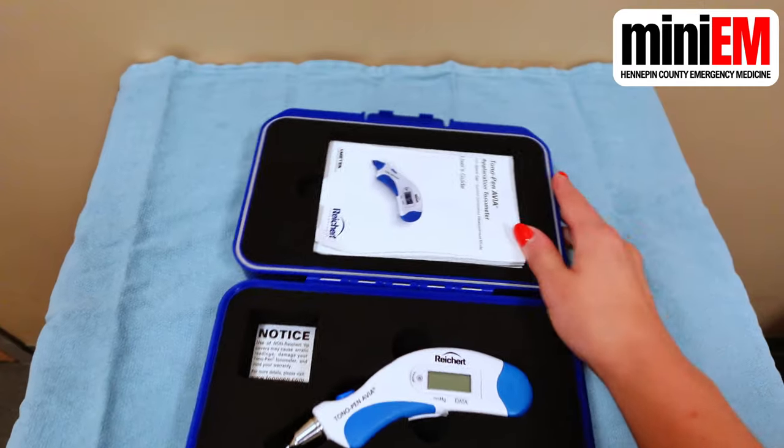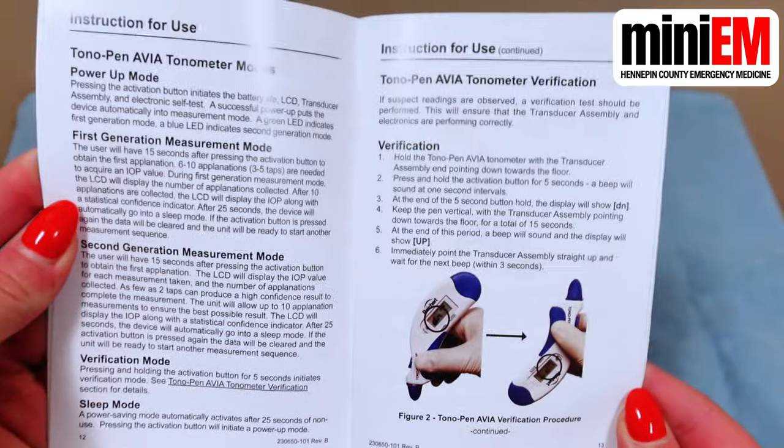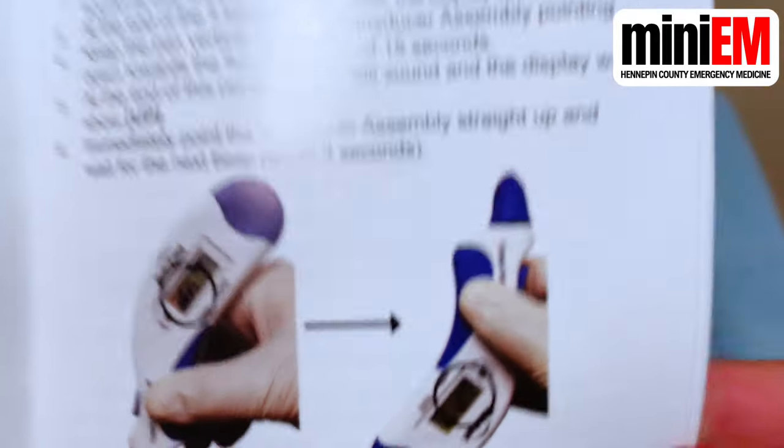You might get an error message when you turn on the tono pen for the first time. If it's telling you to calibrate it, just take out the user guide and follow the instructions there. It'll walk you through tilting the pen up and down to get it fully calibrated. We'll include a link to the tono pen user guide in our video description, in case your department happened to lose their copy.